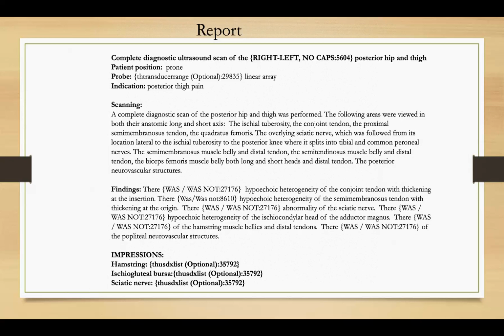And then we look at the semimembranosus origin, again looking at the muscle all the way from the hip to the knee. We follow the sciatic nerve out of the pelvis, as far up as we can go, from the greater sciatic notch down past the level of the hip, as well as the posterior femoral cutaneous nerve. And then we'll also interrogate the bursa to assess for bursal fluid. We'll describe our findings as well as try to make a very succinct conclusion.